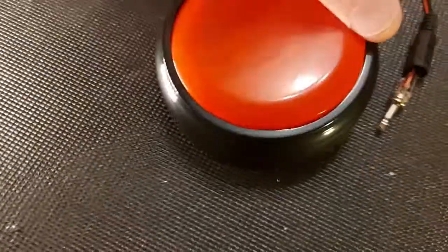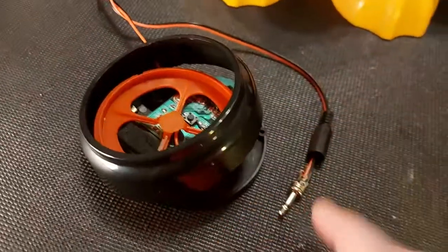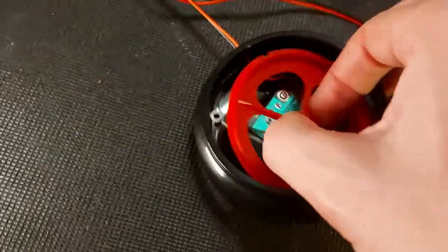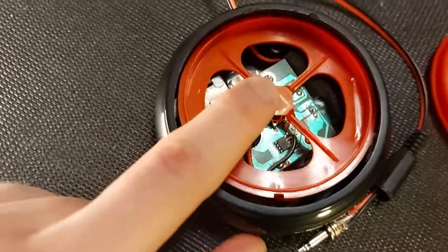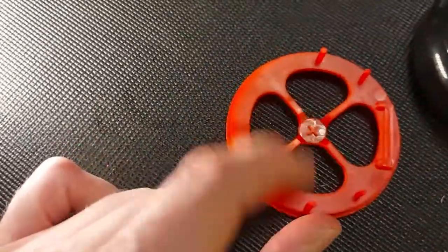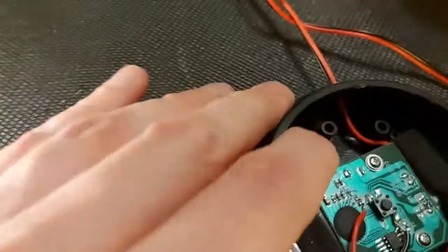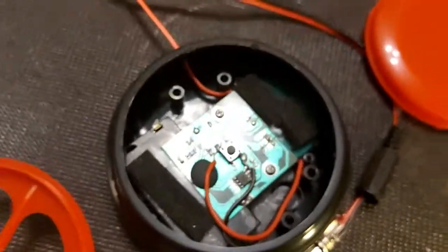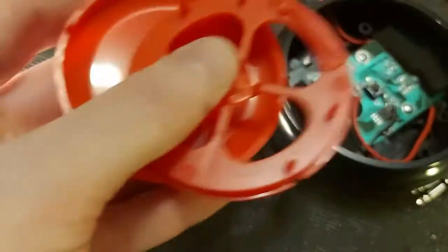I pulled off those little stickers on the bottom and then took out the four screws on the perimeter that allowed me to get inside. You can see it's made up of a switch plate on top, an assembly in the middle, and a little tack switch underneath. What this assembly does is when it's put on just right and you push down, it's going to push down on that little tack switch. The pieces are a little finicky and specific as to orientation, but they're pretty easy to figure out just by playing around.